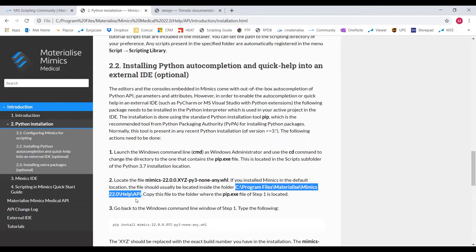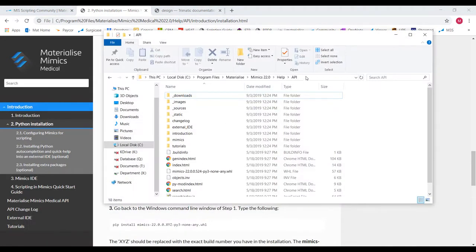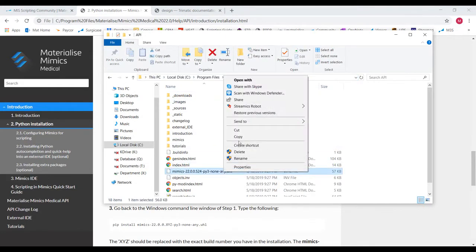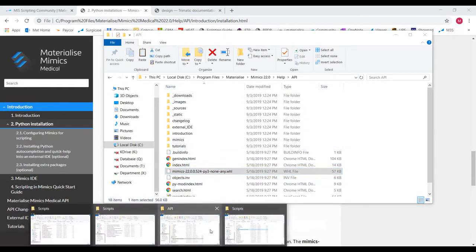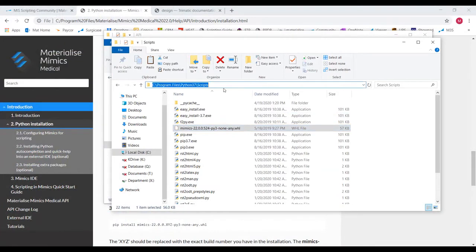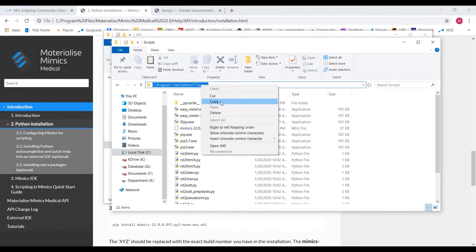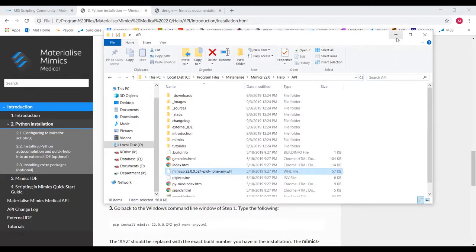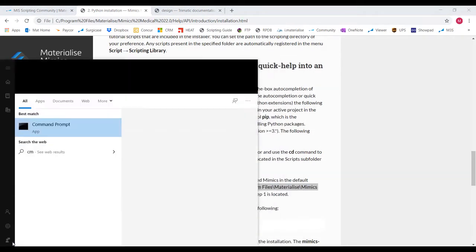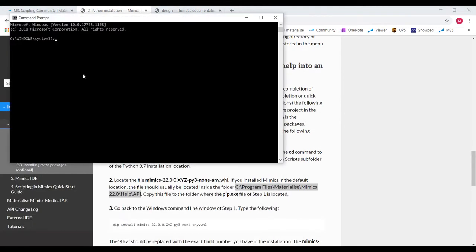This file can be found in this location. So I'll go to that folder and copy it. I'll then head over to that folder location we've been using during the installation and go into the scripts folder and paste that file here. Now we're ready to install all our packages. So let's open the command prompt from our windows search and change that folder location to that scripts folder we've been using.